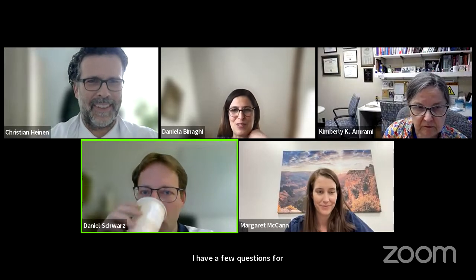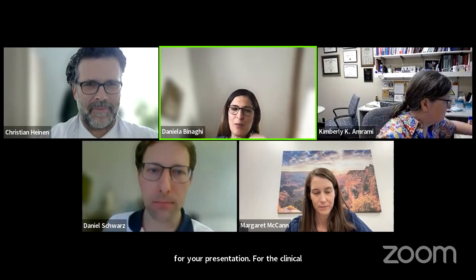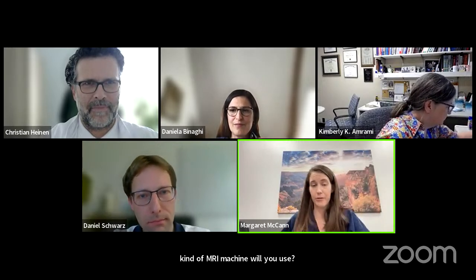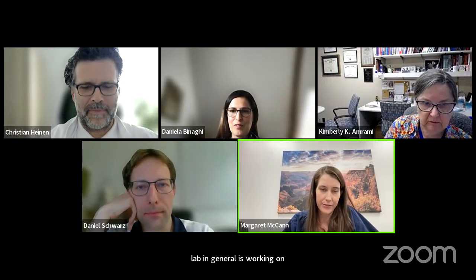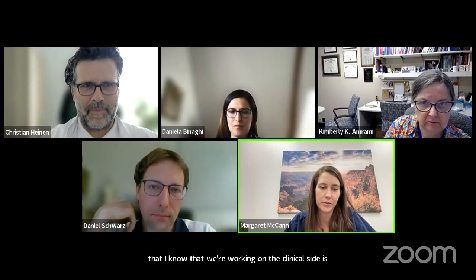Thank you very much for your presentation. For the clinical trial, which kind of MRI machine will you use? So right now, the method we're recruiting for is the DTI. We are in the middle of a scanner change, so I'm not sure which one we're finally landing on and when we're going to be getting it. And that is another thing that the lab in general is working on. I'm very much on the preclinical side, but something that I know we're working on on the clinical side is figuring out a way to get a standardized protocol across different MRIs at different institutions.